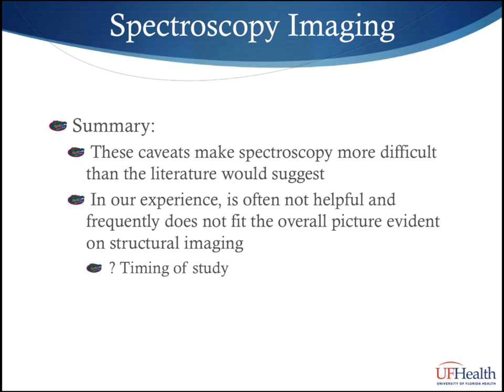In our experience, we found that it is often not helpful and frequently does not fit the overall picture that's evident on structural imaging and clinically evident. This may be related to the timing of the study. As we're about to talk about imaging timing, this will be another important thing to consider when you decide at which point after injury you'll be imaging these patients.